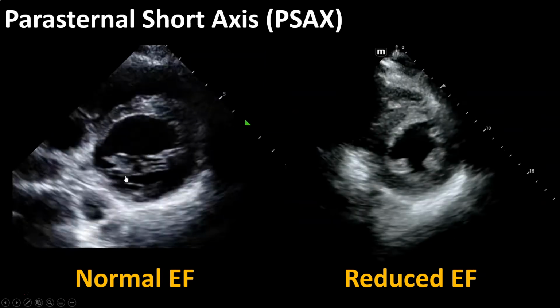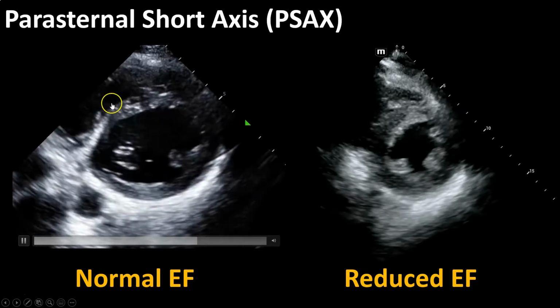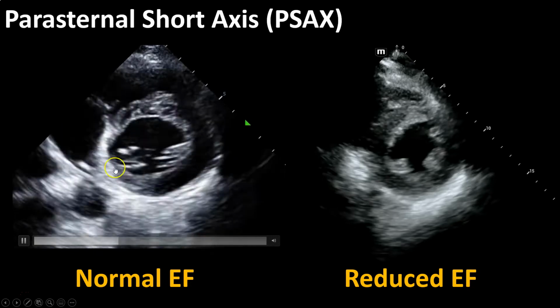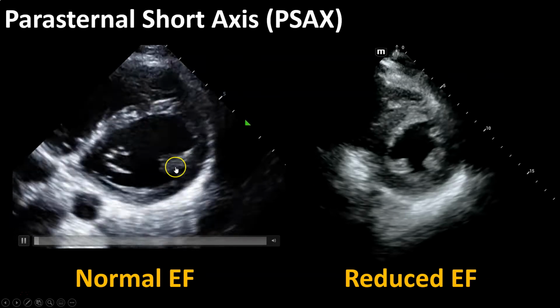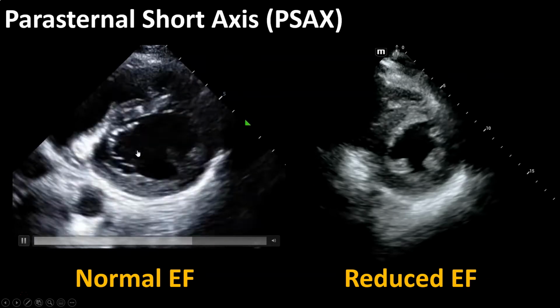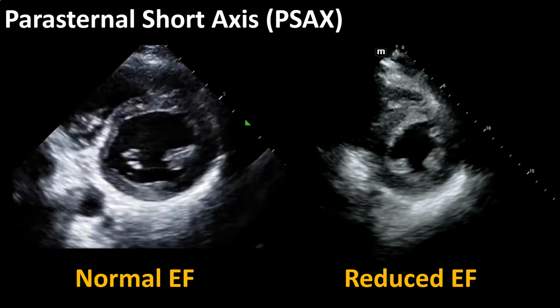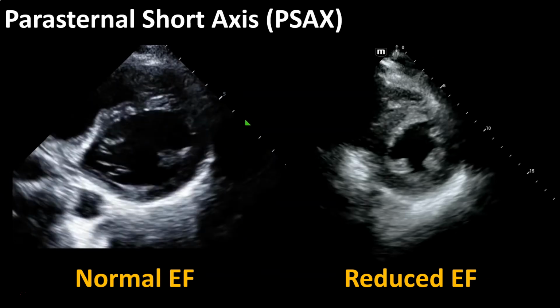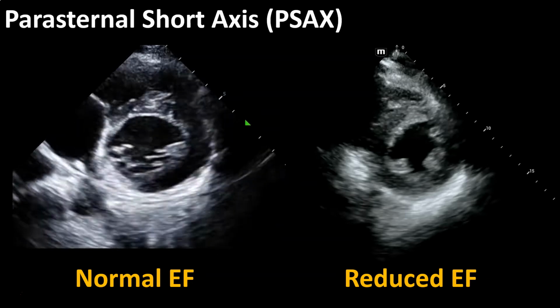So, as a counter, the parasternal short axis view, which we covered in the previous video, how to get it, you're looking to see if you're getting the strong symmetric contraction in all parts of that myocardium, and you're specifically looking at the level of the papillary muscles. If you end up going a little too proximal, and you end up going closer to the base of the heart, you'd end up getting at the annulus of the valve. The annulus, as a reminder, is fixed. It does not tend to move much, so you'd get an artificially reduced ejection fraction.